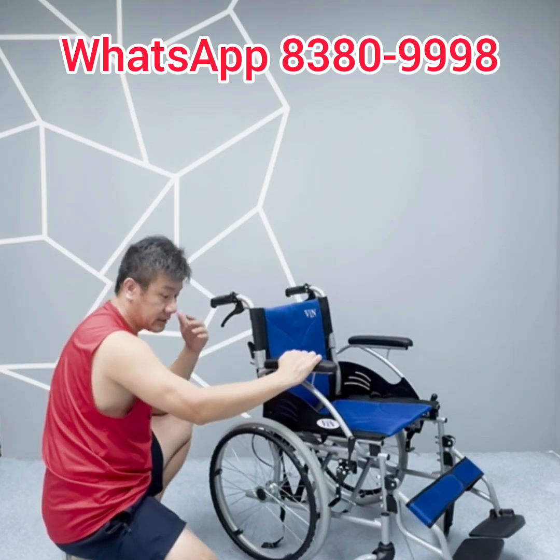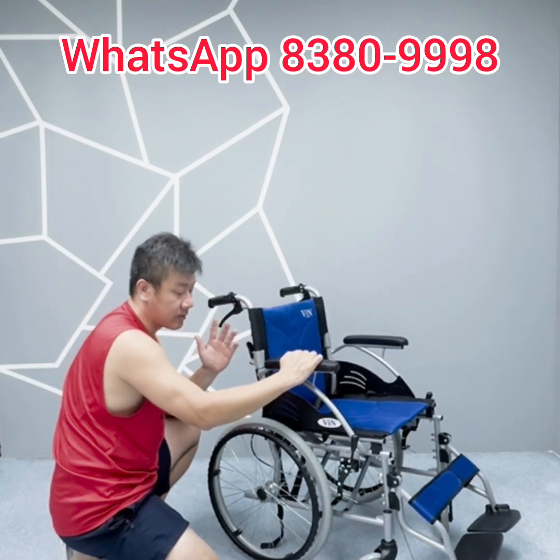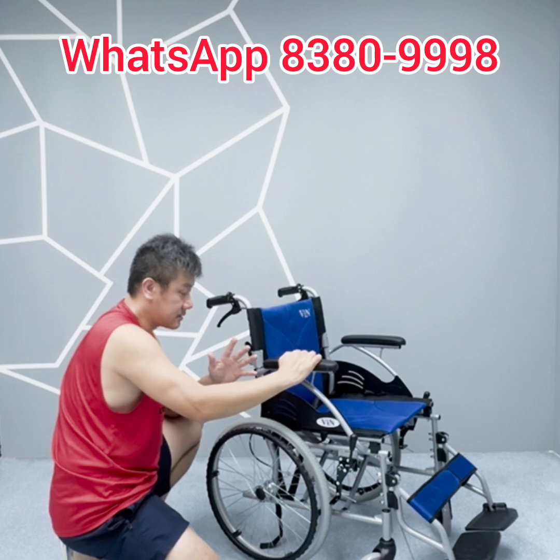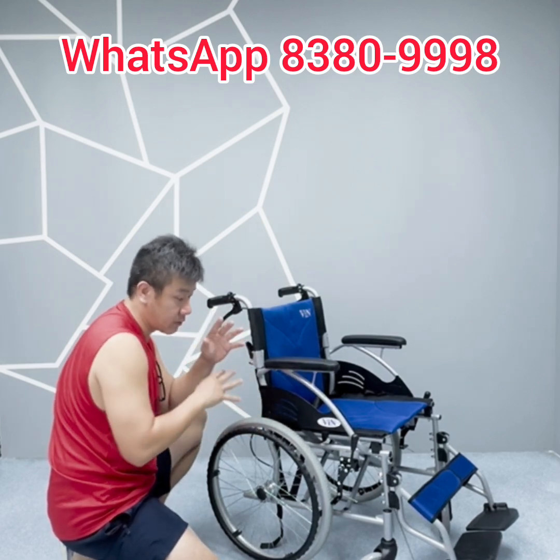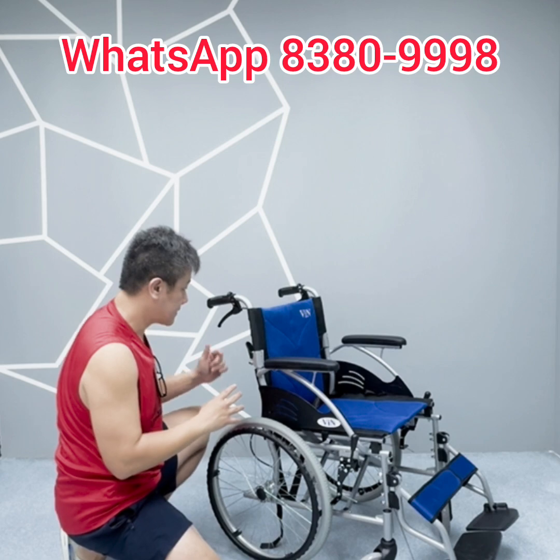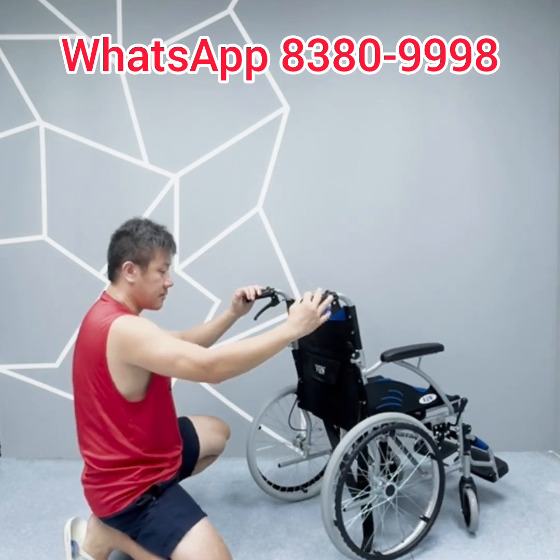This is not a low quality dropshipping wheelchair — this is a very high quality wheelchair. We personally customized it and looked into every aspect to make sure everything is perfect before launching. This is a very good wheelchair, and it is almost maintenance free.